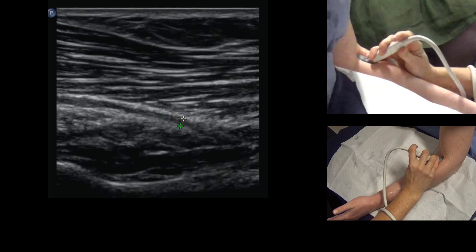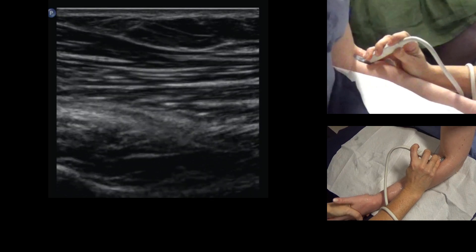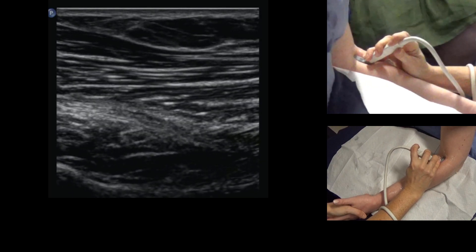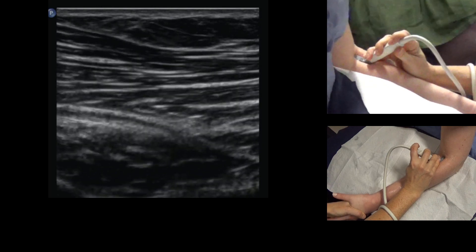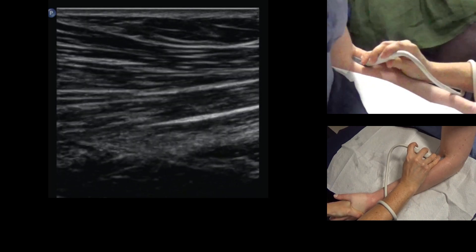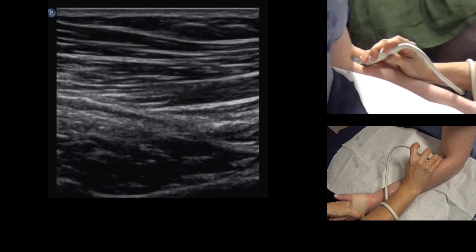Then it gets tricky from there. If it's not hard enough to find it, we then need to perform some movement. You're going to shake hands with the patient and ask them to try and turn the palm down to touch the pillow — palm down — and you're going to resist them. So if you can pronate for me — it has to be fairly strong. You can see there's not much change happening because this muscle is a supinator and we're performing the action of pronation.